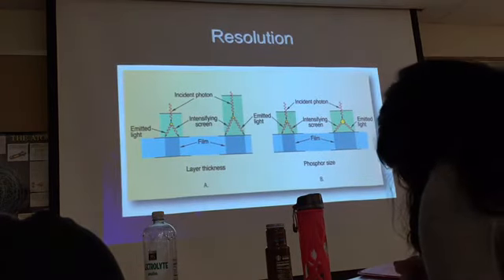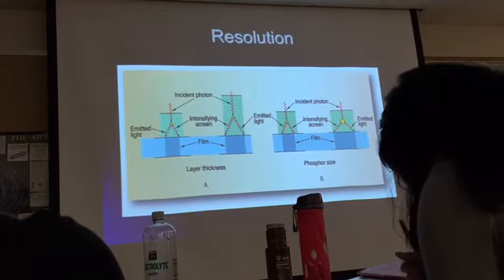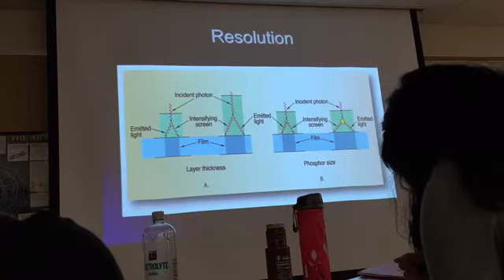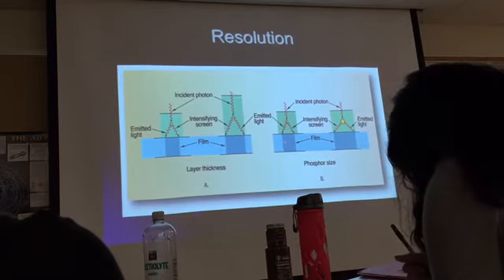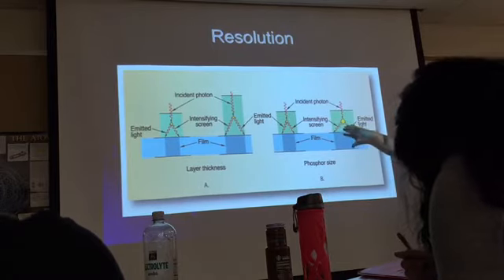Okay, the smaller the phosphor size, the same thing that happened here. Very narrow area that is exposed on the film. With a thicker phosphor, it expands more.